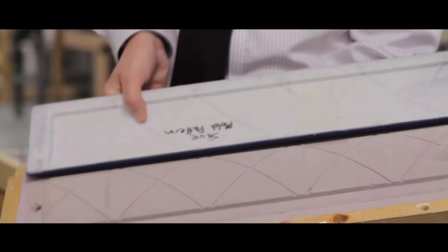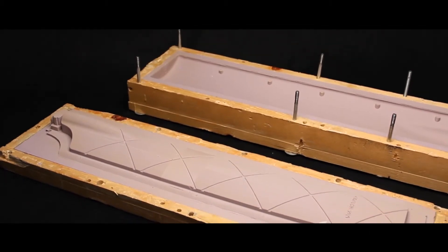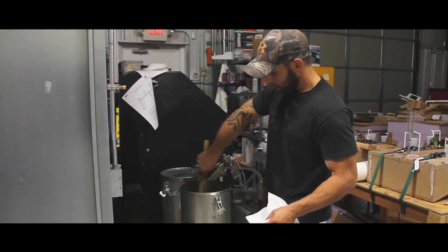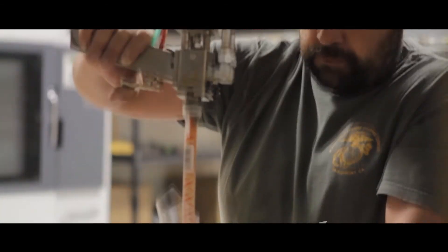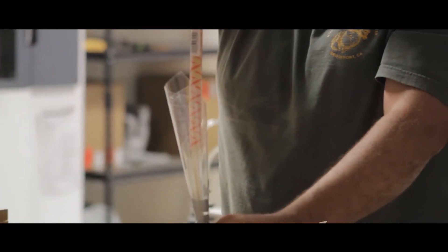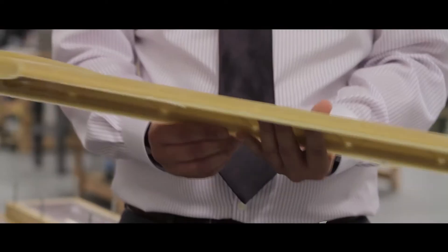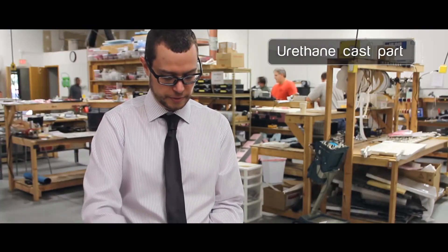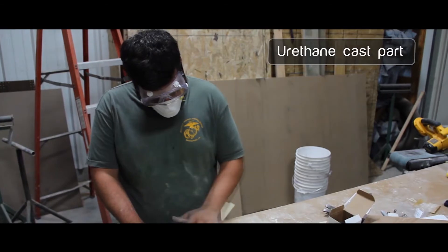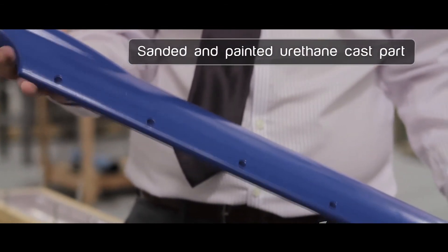Once we have the pattern ready, the next step is to make the molds. After the mold is complete, we inject it with urethane, which is an MRI transparent material. This is the molded part — it comes right out of the mold. There's a little bit of flash where the parting line is. We snap that off and sand it smooth. It's primed and painted for a finished part, and then we're ready for assembly.